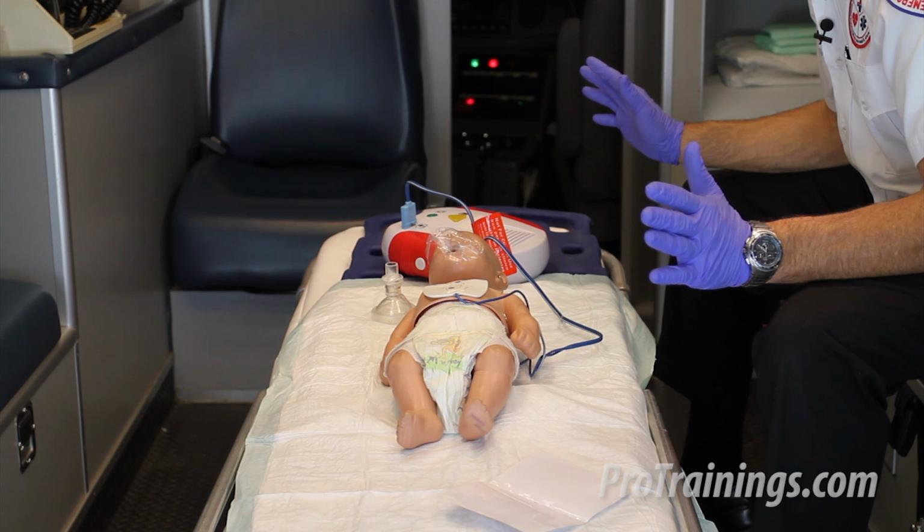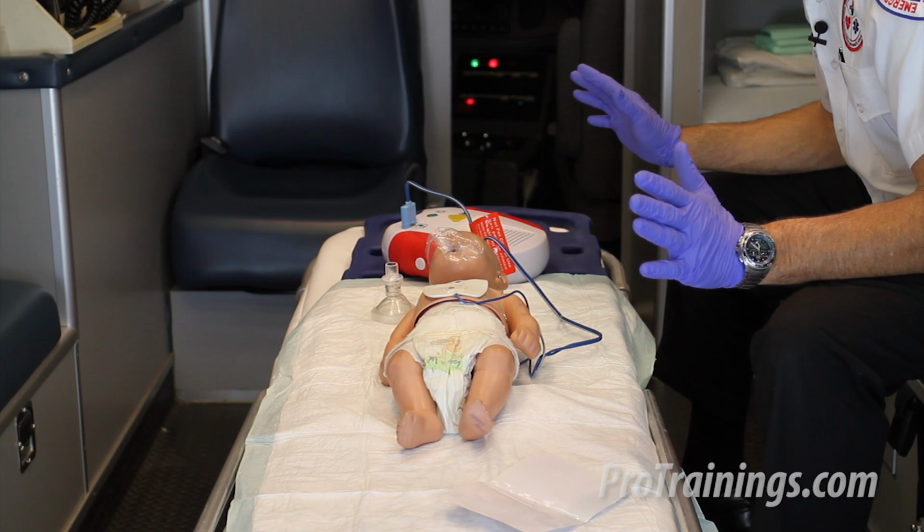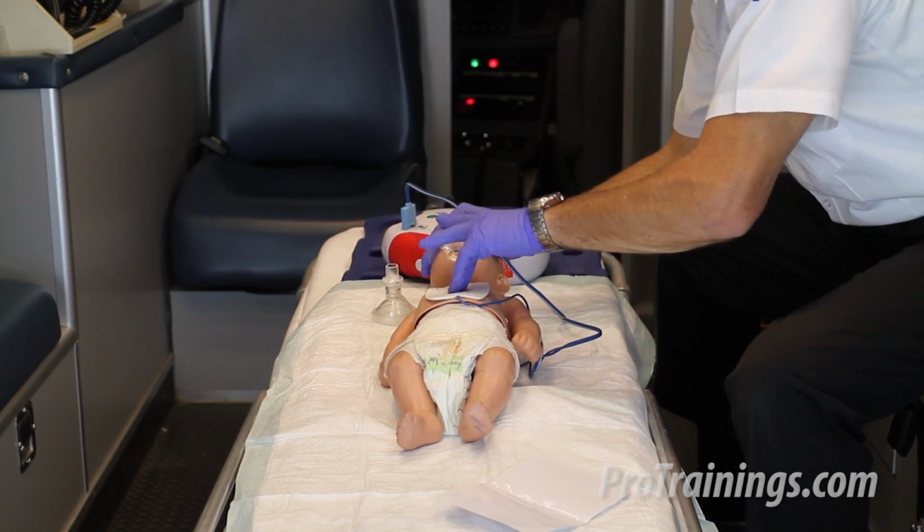Shock advised. Charging. Everyone stand clear. Everyone stand clear. Push the shock button. Clear. Shock delivered. Begin 5 cycles of CPR.